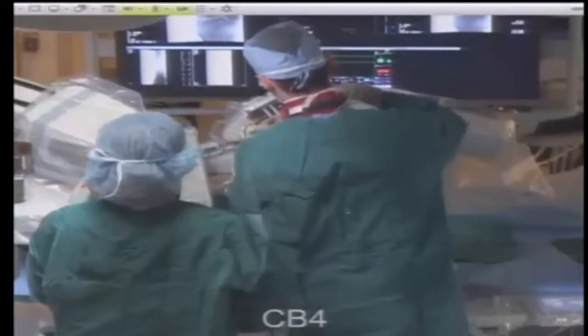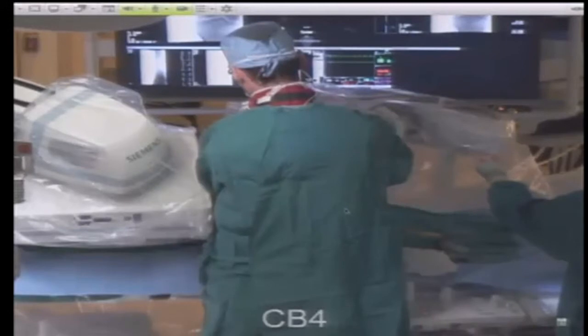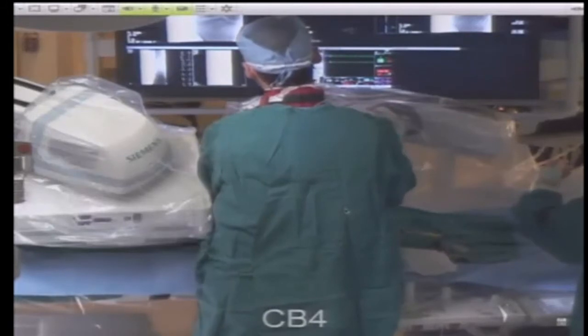This is Marie, our first-year vascular surgery fellow. The way people get to this level is she's done five years of general surgery and is now doing two years with us in vascular surgery training. They're going to put a different wire down there, then bring the balloon in. What you're looking at is one of the most sophisticated imaging systems around — this is also a robot, designed by Siemens and derived from the car assembly industry. It's a huge mechanical robotic arm that sits in the corner and allows us to move it into whatever position we need. You can see how close he is — the radiation source is actually under the patient. See how fast the wire moves when we know we're inside the lumen of the blood vessel.